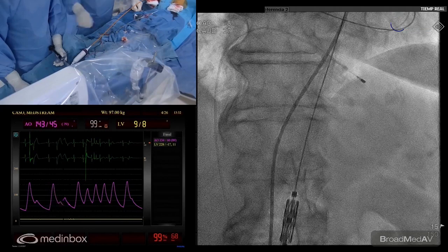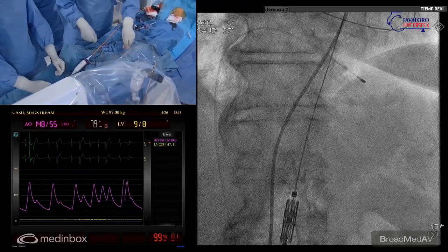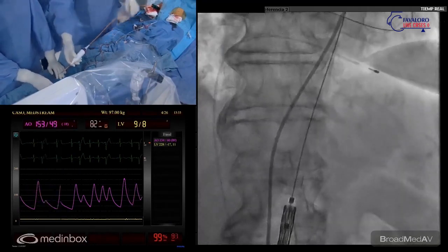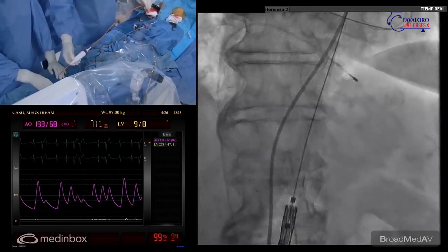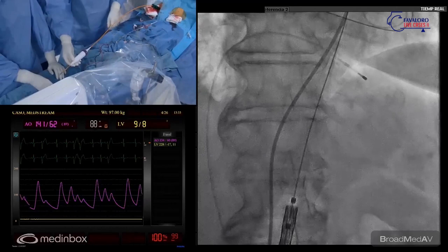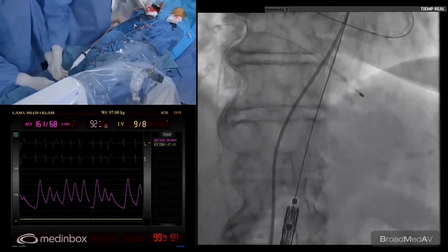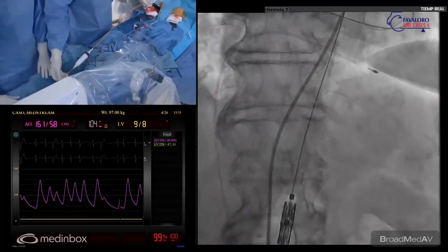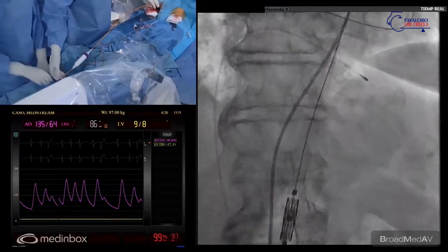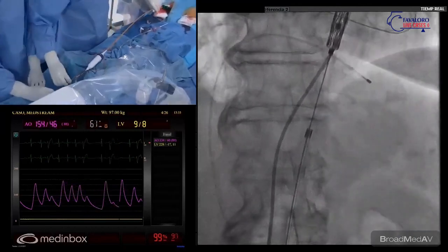So probably we can describe something here. First, we don't have to load the valve as we had to do with the other balloon expandable valve. And also the sheath is a deflectable sheath in the same way. Is that correct? Exactly. And do we have to pull here or something before delivering the valve? We only have to advance. And before crossing the arch, we have to deflect, 50%.